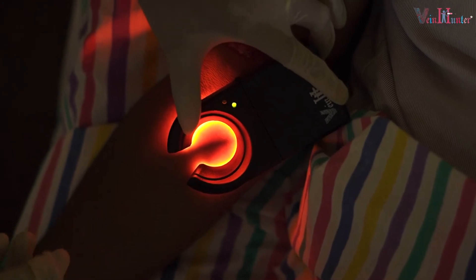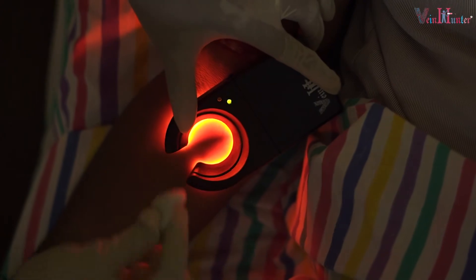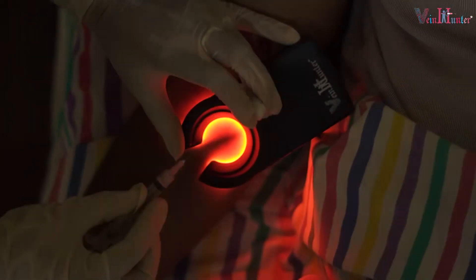Now you won't get any vein rolling, so you can make your needle insertion safely done without any doubt about missing the vein.